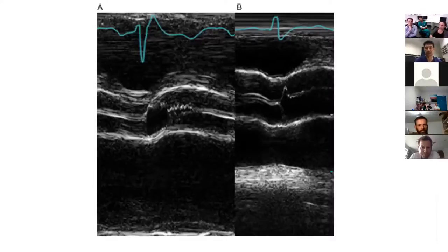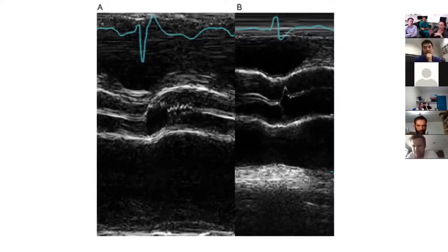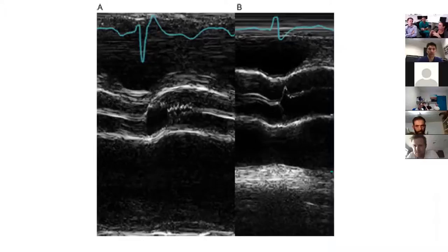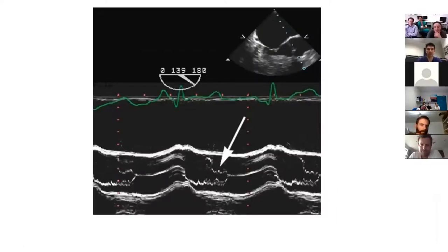The picture on the right shows a sub-aortic membrane — a fixed obstruction at the sub-aortic level. The valve opens very briefly at the beginning of systole and then closes, because there's an obstruction and the force of contraction is easing off for the rest of systole. It's like a fixed structure versus the dynamic type.